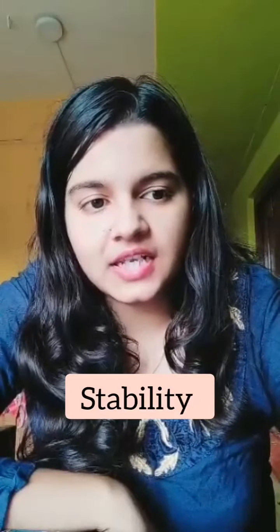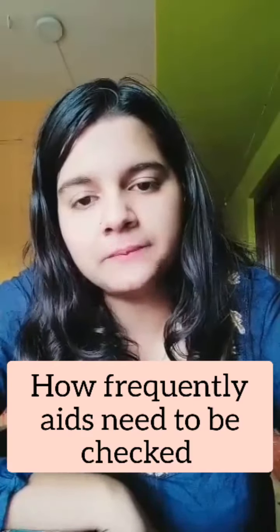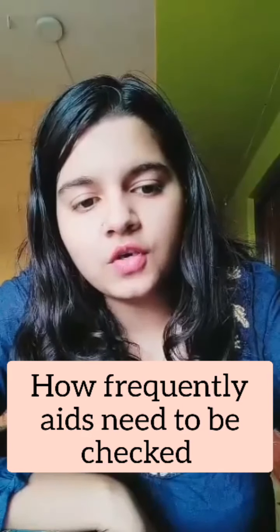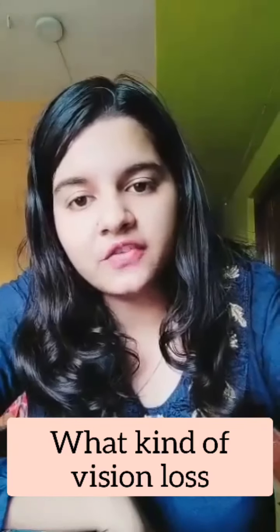The second thing that we'll look for is the stability of condition, like if the patient has to change their low vision aids frequently, or the magnification power is changed frequently. The third thing that we'll look for is if the patient is aware of the condition or not, like what kind of vision loss they are having, is this acquired or congenital. And the fourth thing that we'll look at is the current visual status.